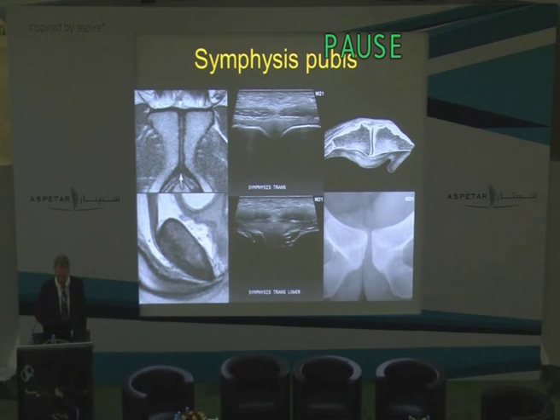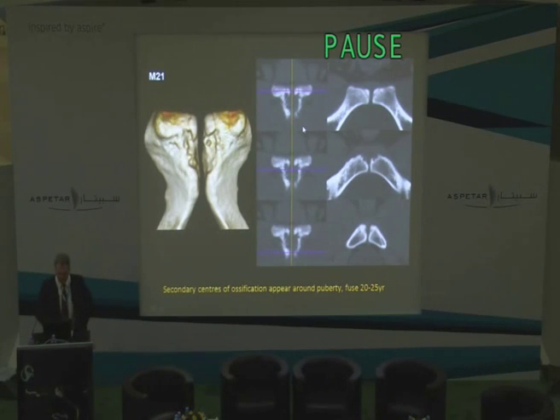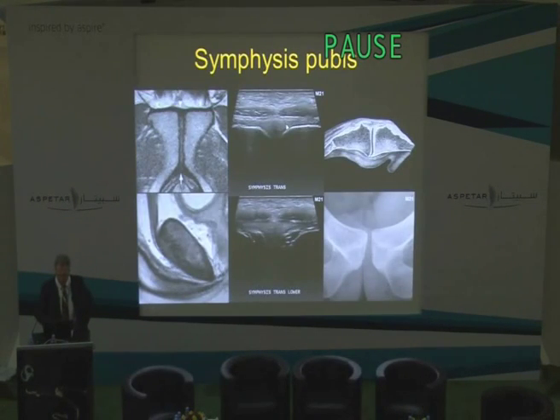But if we now look at the ultrasound equivalent of this, in two transverse sections here in a young patient, firstly at the pubic crest level and then a little bit further down at, say, mid-symphysis pubis level, you see the appearance of a normal anterior pubic ligament. And the normal ligament is a very uniform echogenic structure. It has a very thin black line here at the ligament bone interface, which is the fibrocartilaginous zone of transition, which all entheses have.